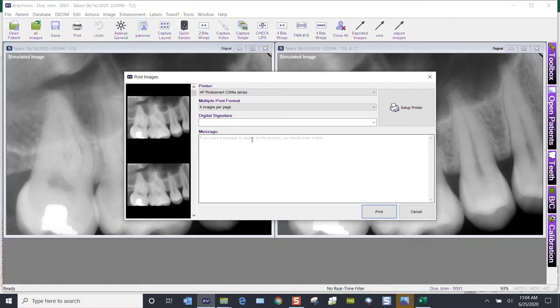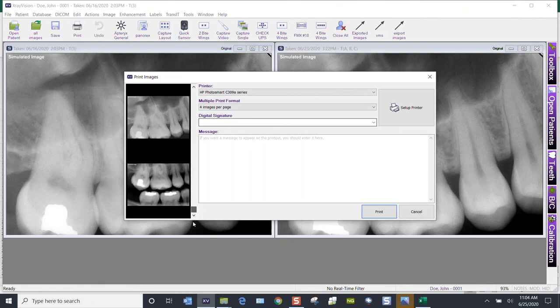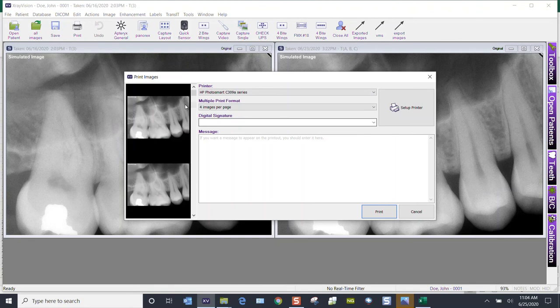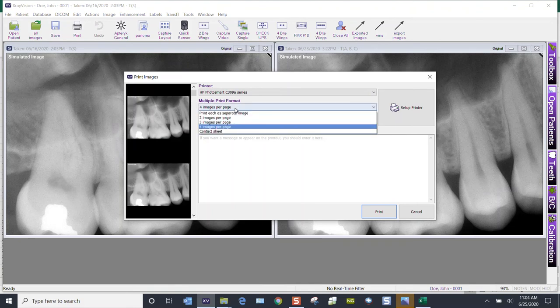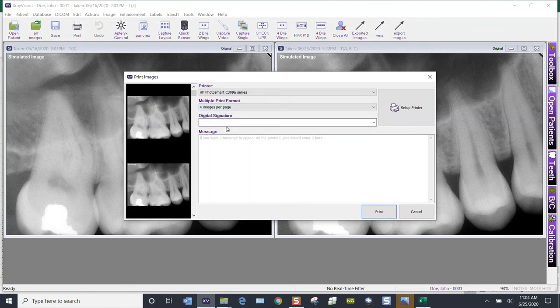It's pulled up this screen here. If I scroll through, I've got all of those images that I selected. I could choose to do four images per sheet, which is typically what I do.